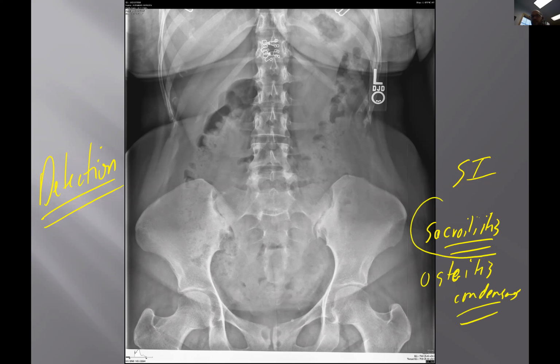And under the sacroiliitis, if you're getting bilateral symmetric changes, AS or enteropathic arthropathy, but I like AS if that were the case. If you had more bilateral but asymmetric appearance, then another seronegative spondyloarthropathy such as psoriatic or Reiter's disease, remember that one? Also called reactive arthritis.